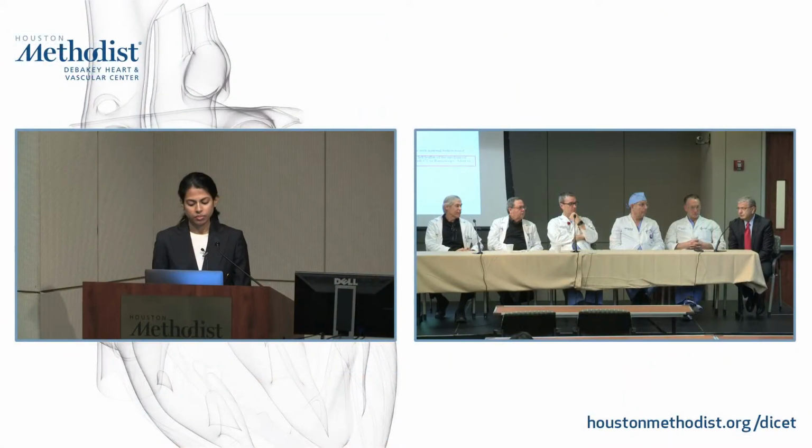You already have a TEE that tells you most likely it's not, that's the issue with TEE and prosthetic valves in the aortic position. Quite often you're not going to see the valves well hinging and opening and closing, so you need another modality before going further. And I think the big question is a reoperation in a mechanical valve or a lytic agent if the patient has significant risk, and so you have to make that decision.